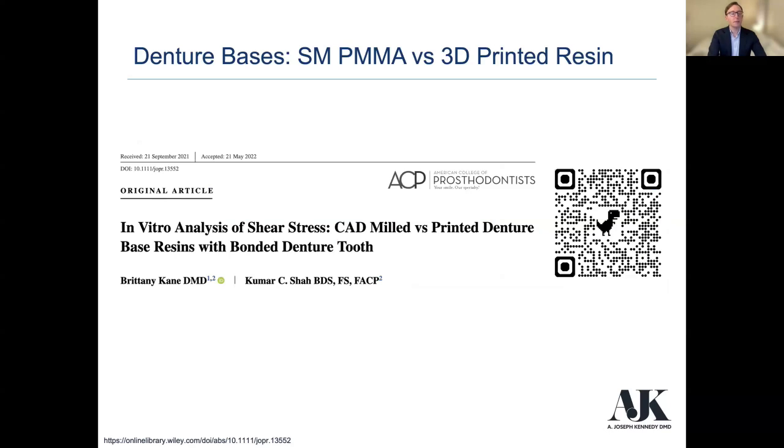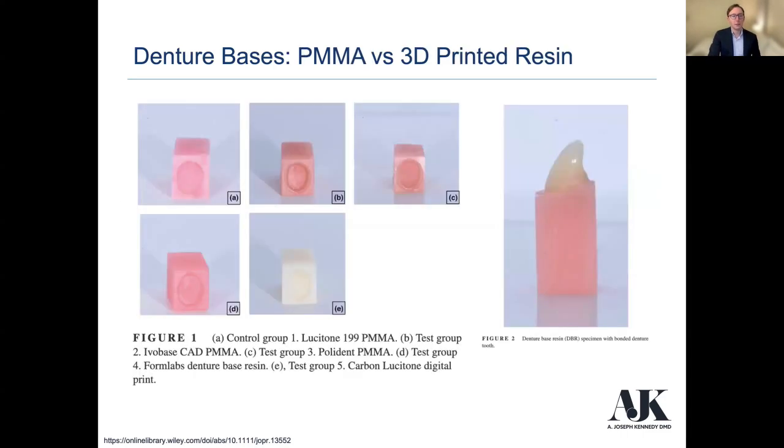So here's an in vitro study again of shear stress from CAD milled versus printed denture base resins with bonded denture teeth. And so this is how they designed the study. They took a central incisor and they put that bonded denture tooth into different types of resin bases. They had a control group, with the Lucitone PMMA.